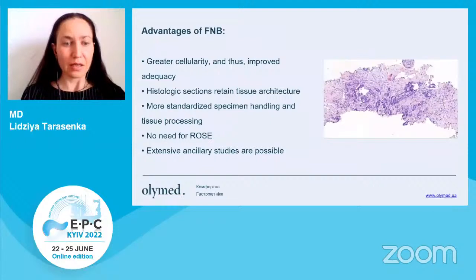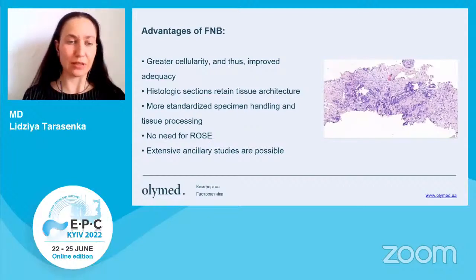For biopsy, we have two options: aspiration, which gives us cell blocks or just smears without tissue architecture, or biopsy with obtaining core tissue. Some differential diagnoses might still be very difficult with smears, such as well-differentiated adenocarcinoma versus chronic pancreatitis.